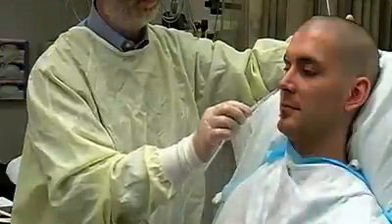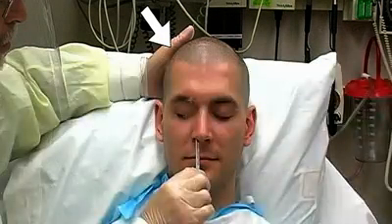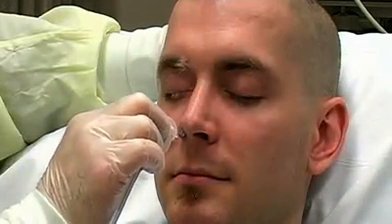Make sure the patient is sitting upright. It may help to place your other hand behind the patient's head to prevent him from suddenly pulling away. Gently begin inserting the tube. Make sure the tube is parallel to the floor of the nasal cavity. It's a common mistake to direct the tube upwards, where its passage will be blocked by the middle turbinate.